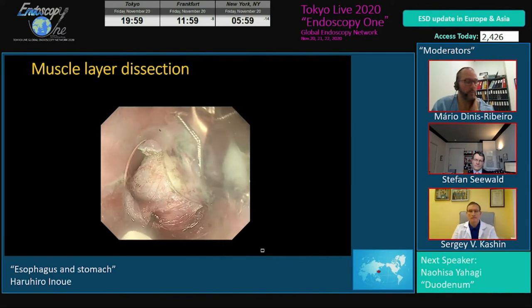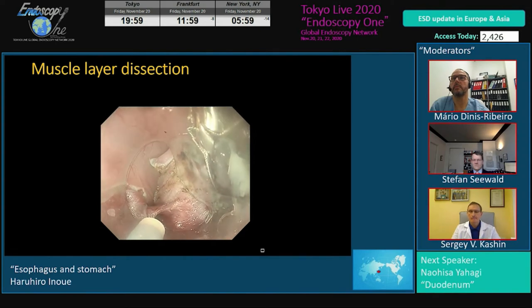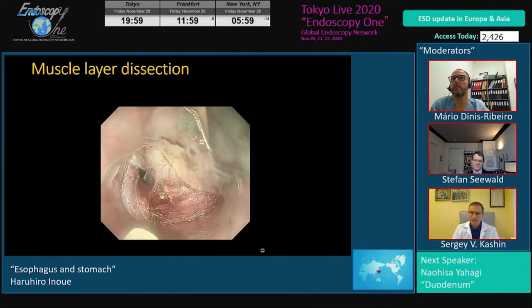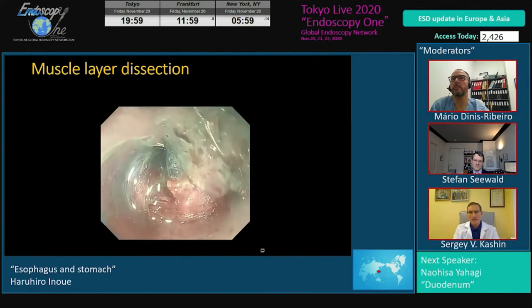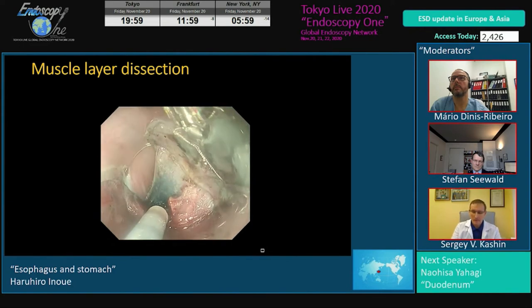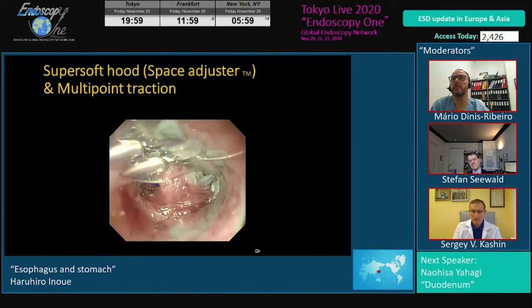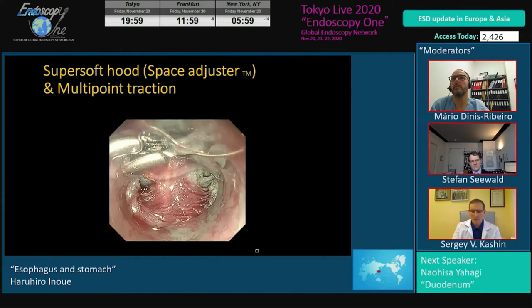So now we are dissecting the left side of the tumor. The muscle layer is directly attaching to the tumor. In other words, the tumor invaded the muscle layer. Injection into the submucosal layer makes a contrast. This is the center of the region, so the tumor is invaded to the muscle layer.